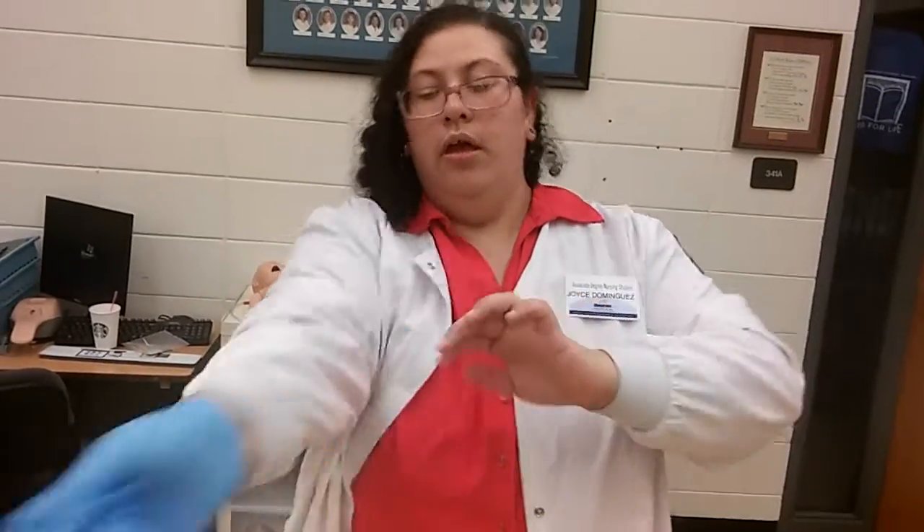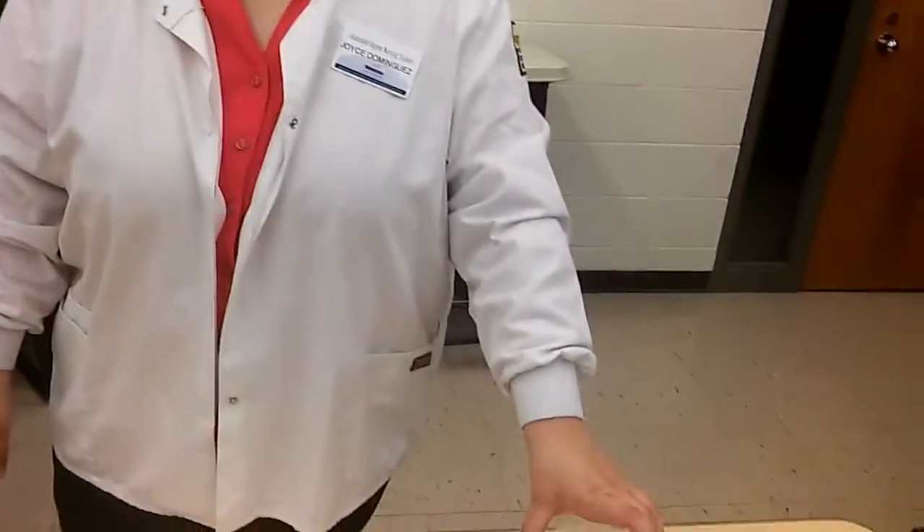We're going to remove our gloves and place the patient in a position of comfort. We're going to measure the return contents, then perform hand hygiene, assess the abdomen, and then document the procedure.